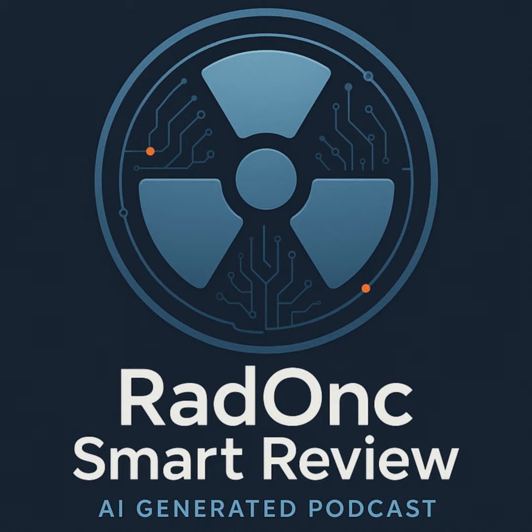Palladium is faster. Okay. And for evaluating the success of those prostate seed implants, what are two key target coverage metrics we look at on the post-implant dosimetry CT scan? And briefly, what do they represent? The two big ones are V100 and D90. V100 is the percentage volume of the prostate receiving 100% or more of the prescription dose. It measures how much the target volume is covered by the desired dose level. Okay, V100 for volume. And D90 is the minimum dose received by 90% of the prostate volume. It's a measure of dose adequacy in the potentially colder regions of the target, indicating how well the bulk of the prostate is dosed, aiming to minimize significant cold spots. D90 for dose adequacy. Great.